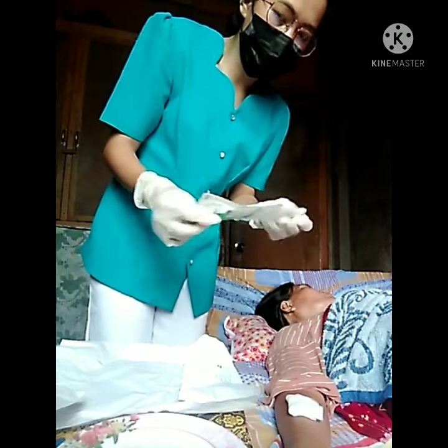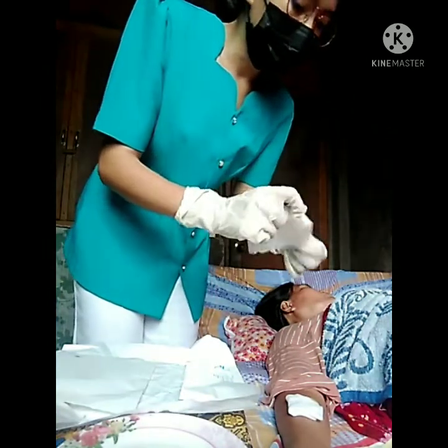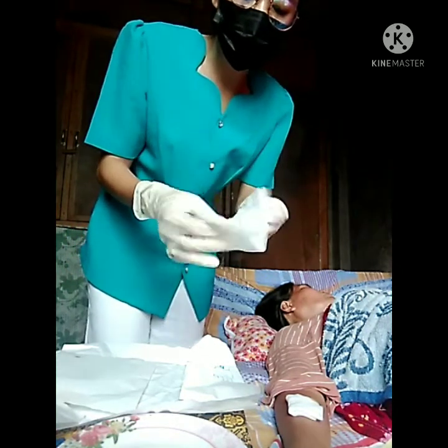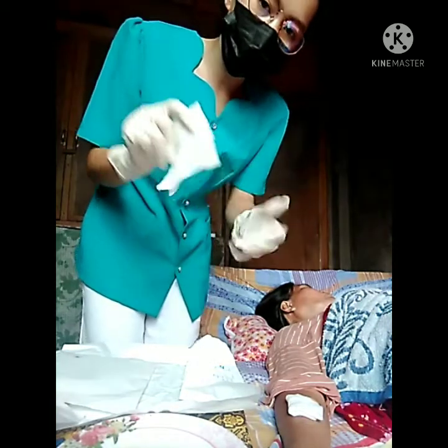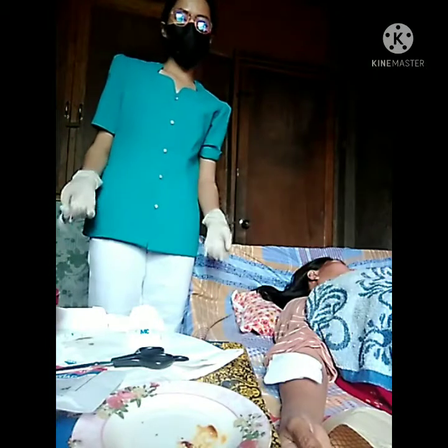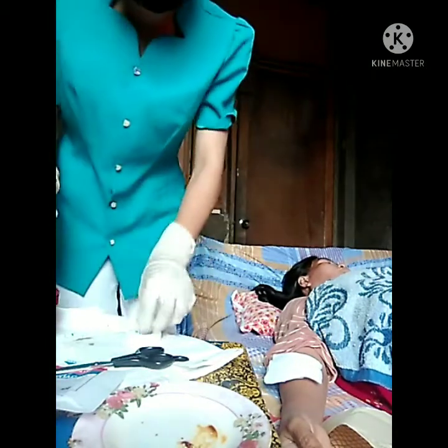over the wet gauze. So this is 4x4, so you won't have to cut this. And the next step is to put adhesive tape over the dressing.